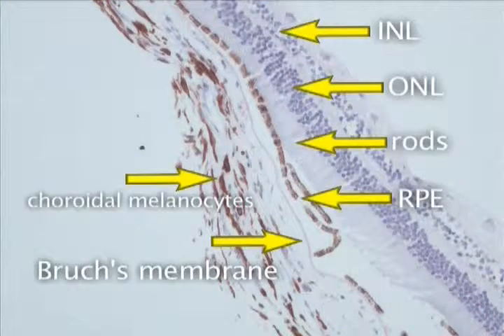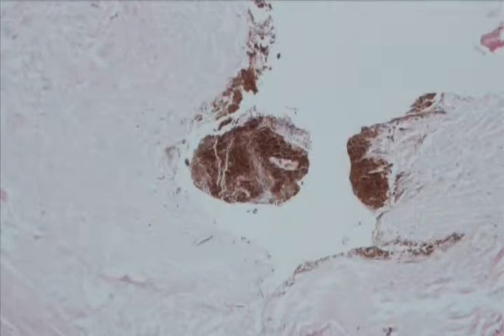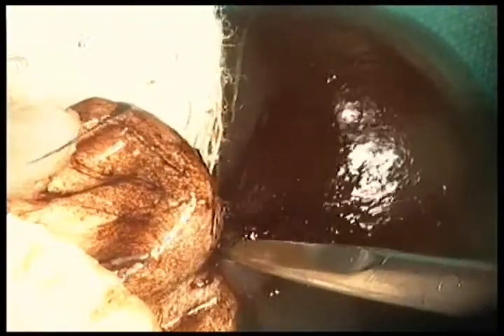This is the anatomopathological image, reported as melanocytosis. Now, we cut the optic nerve head.